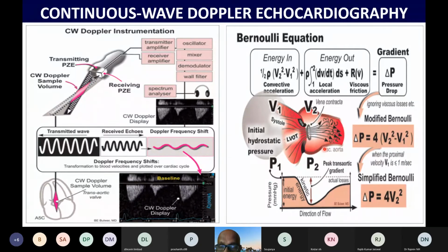This is especially true in an aortic root which is narrow, less than 2 centimeters in diameter. This occurs. If the aortic root is wide, this is not a big problem. But as I said, the initial first reason for increased pressure gradient during echocardiography will still be present there. This is about continuous wave Doppler.